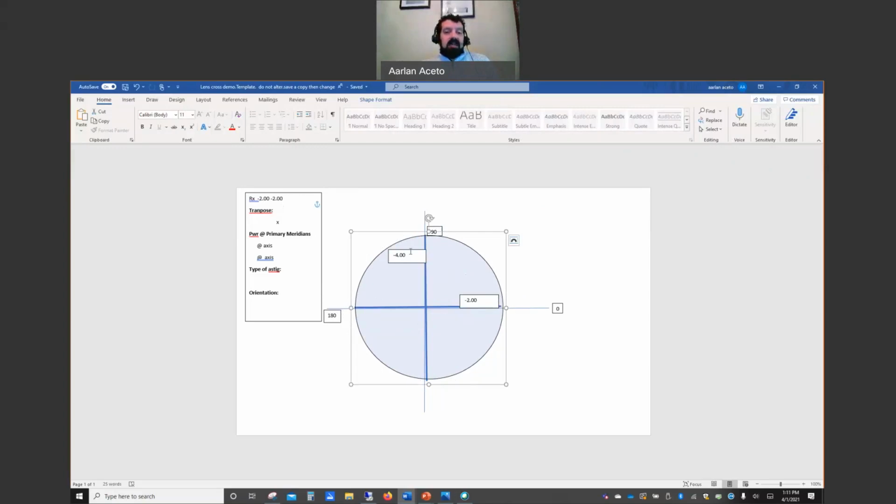Well, if a steeper cornea causes more myopia, my question to you would be, which is steeper, which one's flatter? Well, whichever one is more minus is going to have a steeper corneal meridian associated with it if the eyeglass prescription and the corneal curvature match up, which they generally do.